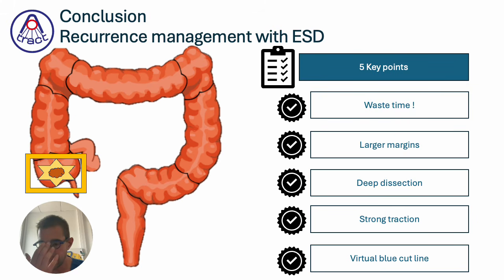And when you have the fibrotic area, try to create a line between blue and blue, passing through the fibrosis, with an axis which is virtual, but which is directed or guided by your two blue areas at the two edges of the fibrotic process.